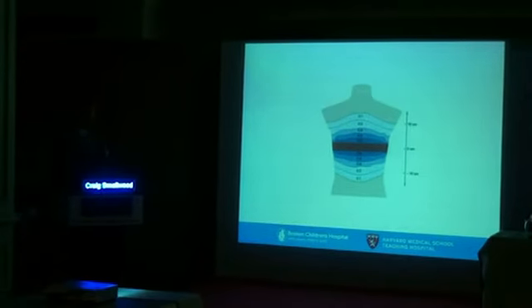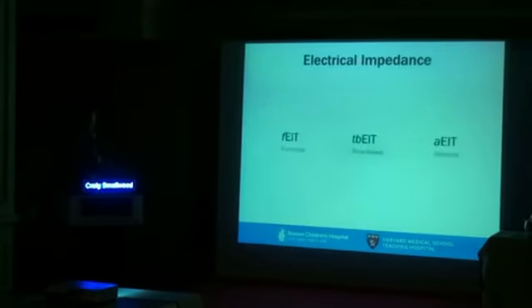Interestingly, electricity does not travel in a straight line. So unlike an X-ray, which is pretty straight, you can't really make those beams bend a whole lot by reflecting them off of bone or tissue. Electricity basically travels in a football shape. So within the thorax, if we have our band here at this red part, you can see there's going to be a proportion of the electrical impedance tomograph measuring different areas of the body. And that's another important difference.